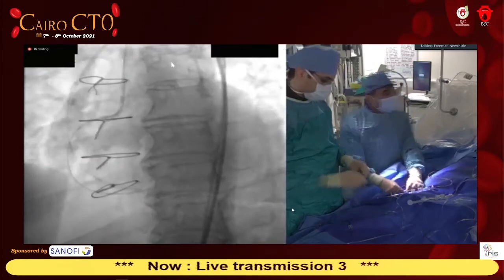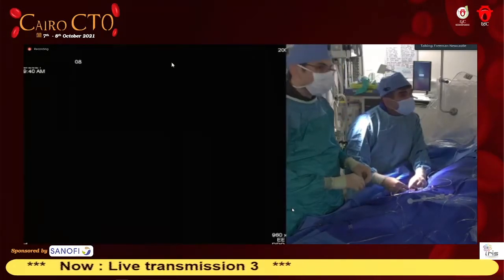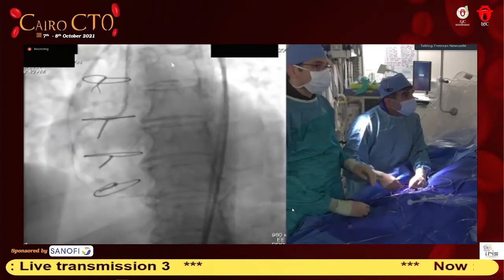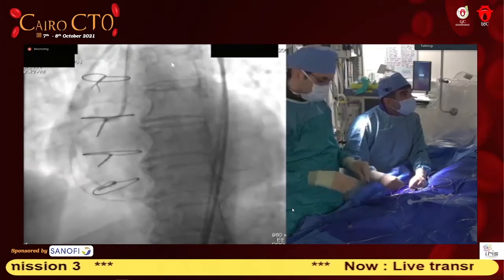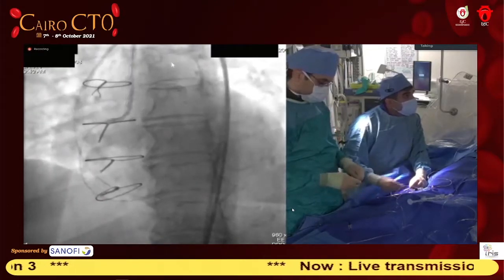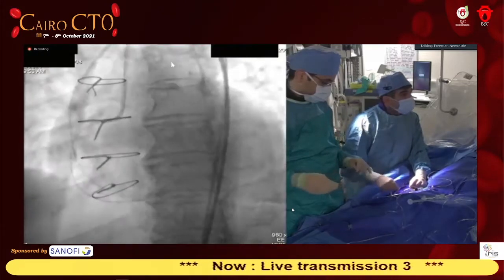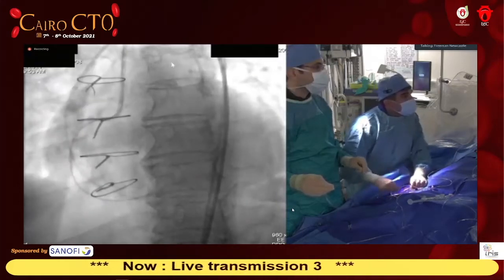Because if you have a problem, you may spend a long time to be able to, I'm getting some heart block here. Yes, she's quite ischemic. So we need to do this quick. Anyway, if there's a problem in the collaterals with the wire out, you could run into trouble. Actually, I'm going to do this quick. I'll leave it for now.